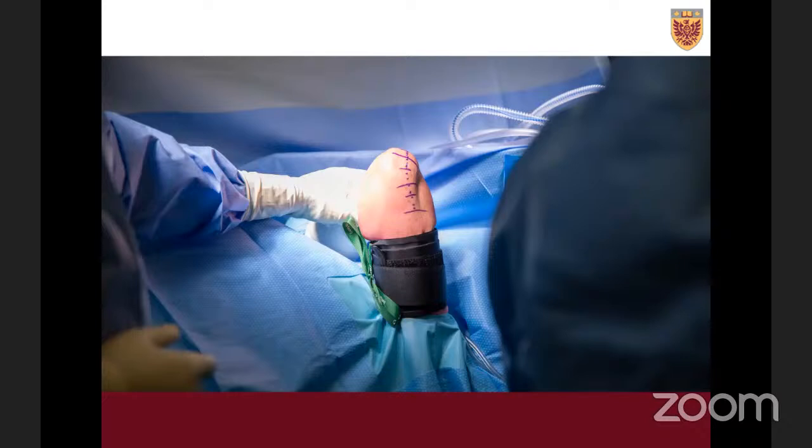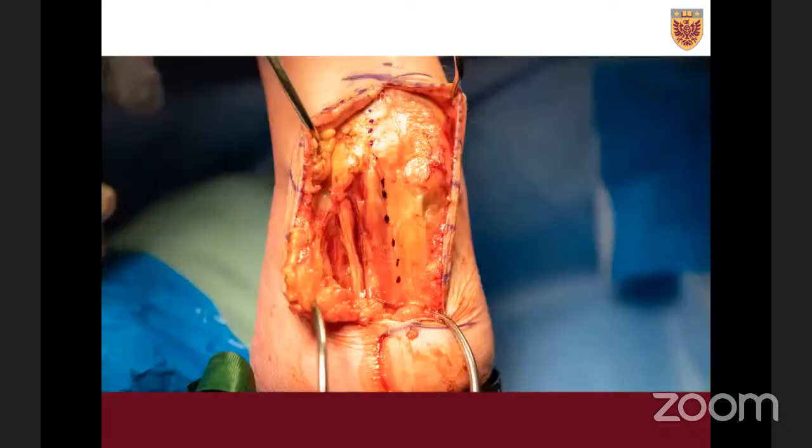I'm going to show a number of pictures to go over the technique. All my patients are positioned supine with a sterile tourniquet, with the arm pointing upwards. I curve my incision either slightly laterally or medially away from the olecranon tip to decrease point loading on the tip with the scar. After the incision, I start to expose and unroof the ulnar nerve, but only until just at the cubital tunnel. When I started this approach I would not encirculate the nerve — I would just unroof it right to the cubital tunnel and stop there.